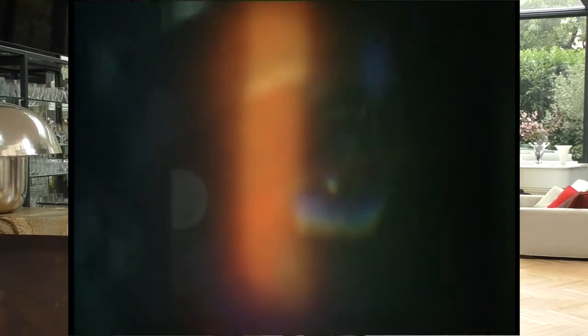Now let's go to the quadraspheric lens, always in the same patient. And there you see it is a marvel to see the vitreous, to see, like here, the posterior hyaloid intact and detached. The quality of the image on the central retina is magnificent.